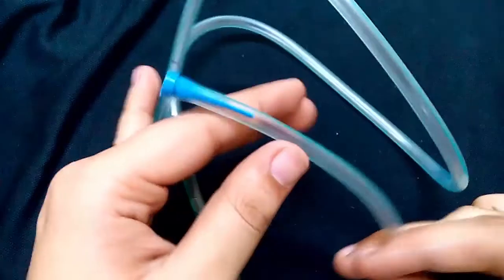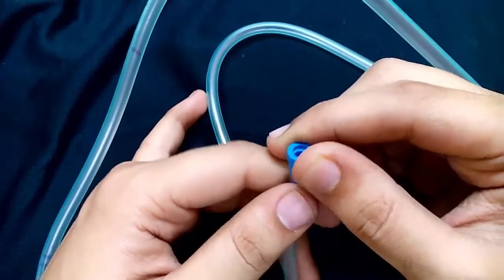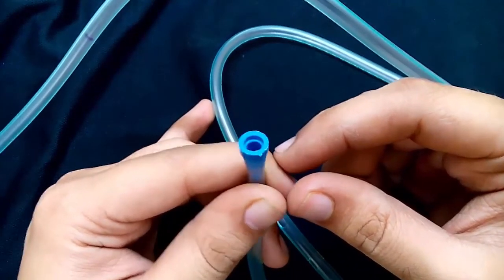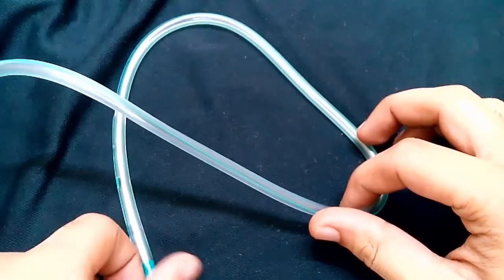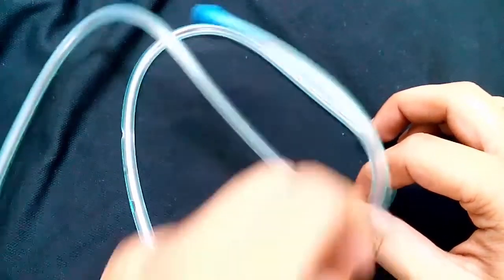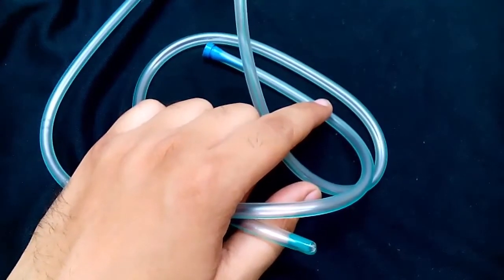The base of the Riles tube has a cork whose lumen is just adequate to accept the nozzle of a syringe. Sterilization of the Riles tube can be carried out by gamma irradiation, ethylene oxide gas, or by boiling. Ideally, the Riles tube should be cleaned with water; it is not necessary to sterilize it.